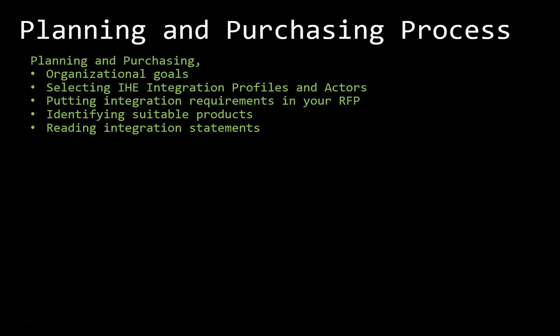Achieving the full benefit of an IHE integration profile requires that systems interacting with the RIS also play their roles as defined in the profile. The SWF and the PIR profiles form the cornerstone of integrating a RIS with other systems in the institution. They establish a seamless flow of information that supports efficient patient care in a typical imaging encounter, in certain exception cases by specifying transactions that maintain the consistency of patient information from registration through ordering, scheduling, imaging acquisition, storage, and viewing. It's strongly recommended that you start with the SWF and PIR profiles for a RIS.